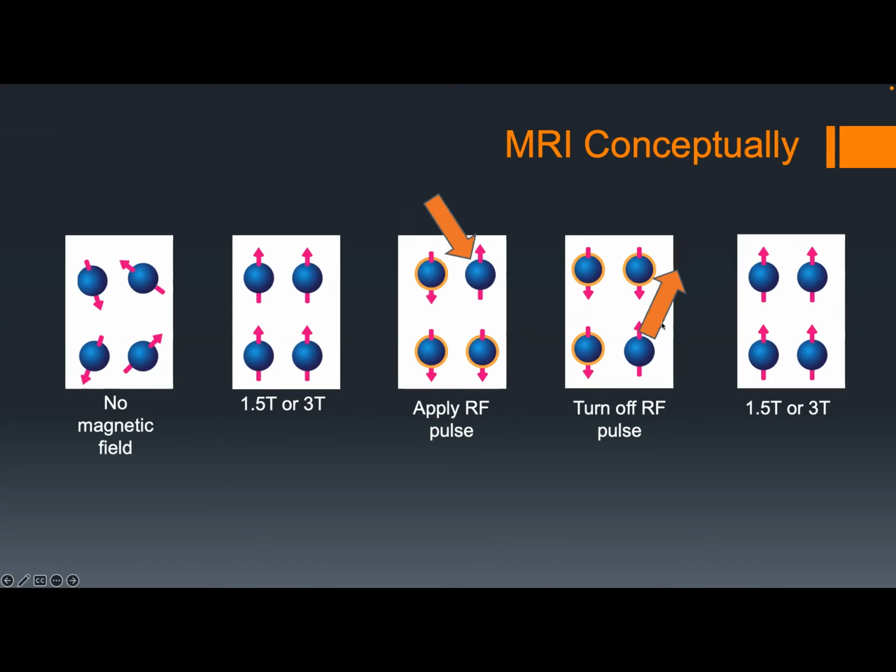Literally, it's a sound. It's an RF pulse. That allows us to do images, right? As you apply the pulse, turn off the pulse, you have perturbed the protons, and then as you listen for the protons to return back to how they were, you are able to generate your image. It's a different world from nuclear medicine, but that's how it works.